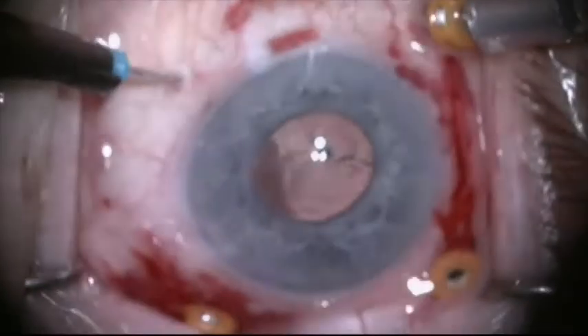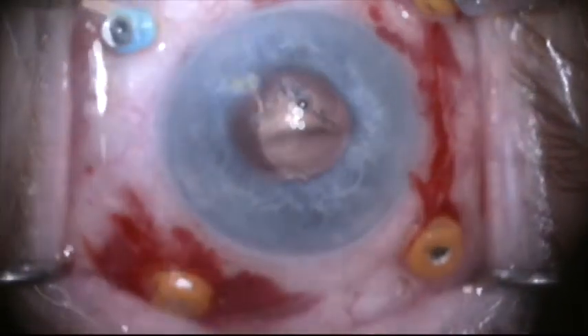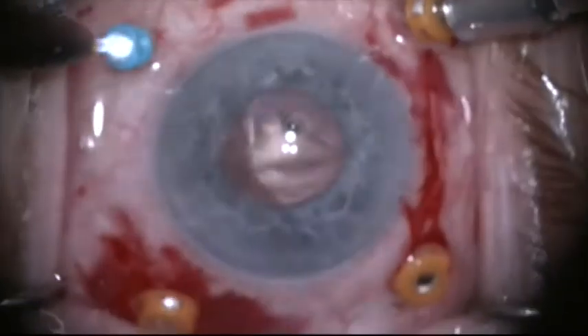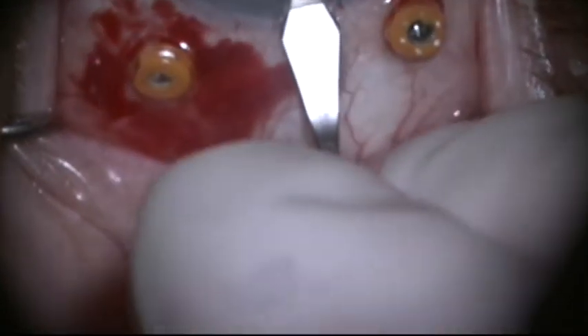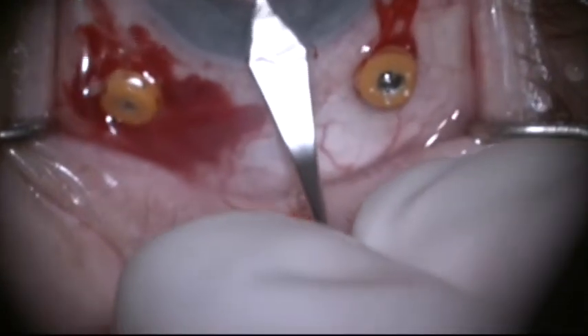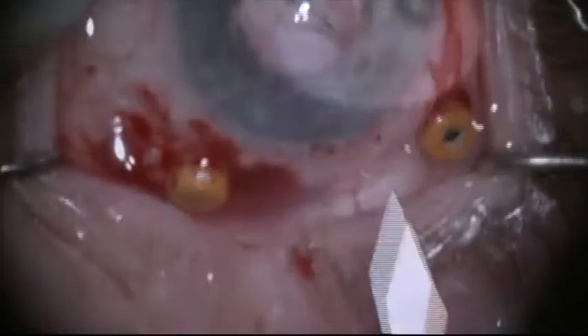After completing the vitrectomy, I'm going to need two hands to do the maneuvering, so I'm going to use a chandelier light, which means adding another trocar for this chandelier light. I'll now preplace my clear cornea incision with a 2.75 millimeter keratome, and of course this needs to be self-sealing.